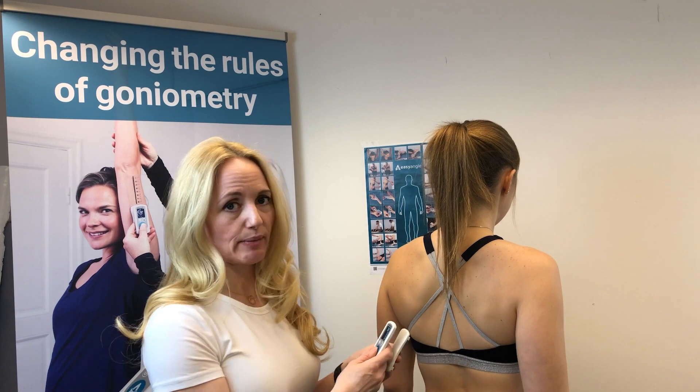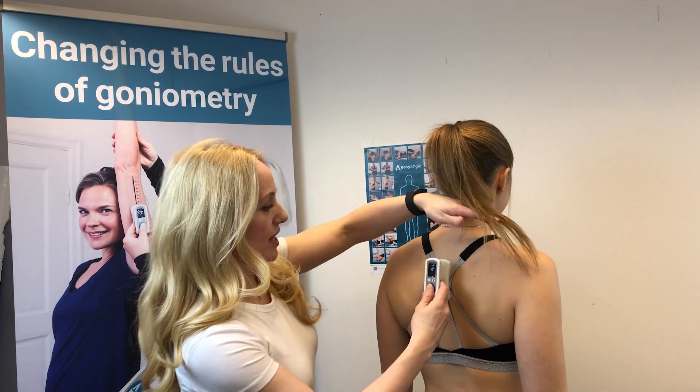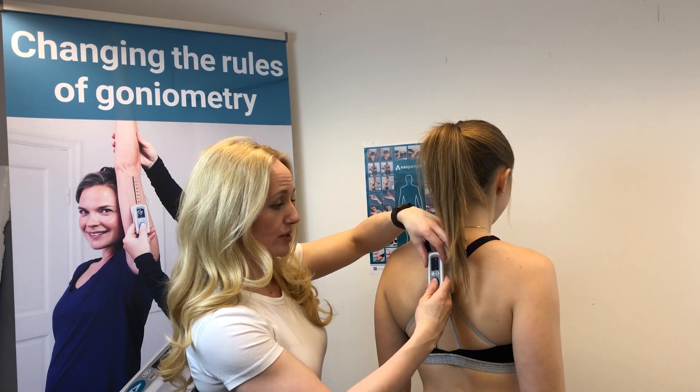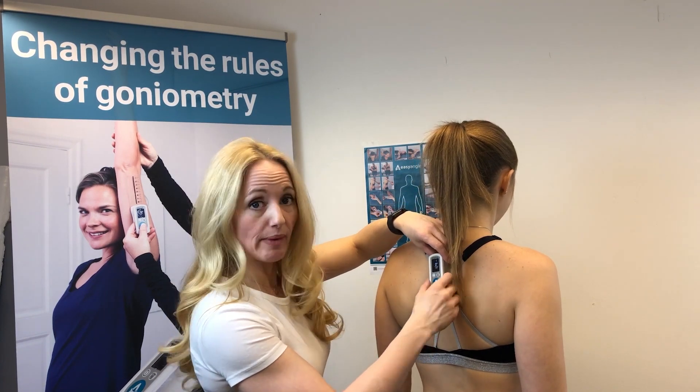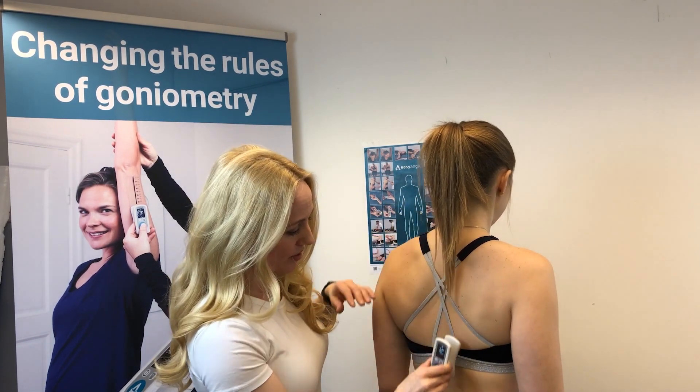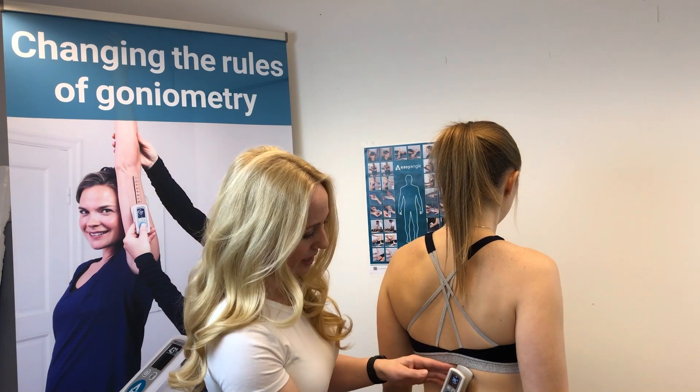It's maybe a little difficult with a patient that doesn't have scoliosis, but for demonstration purposes this is what we're going to do. You press the button to get your blinking zeros, come to the top of the scoliosis, align the device with the spine, press the button to start the measurement, then come around the curvature to find the base of the scoliosis at the last vertebra that is out of alignment, press the button, and you get the Cobb angle.